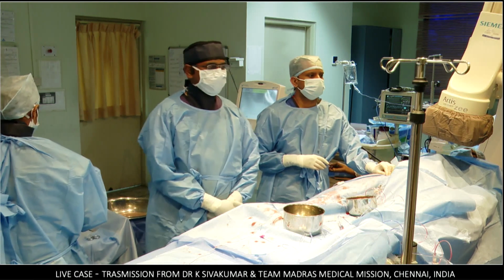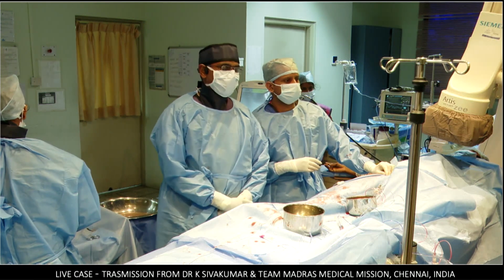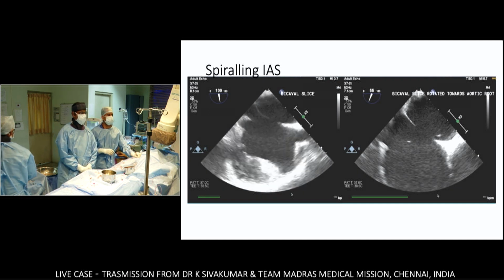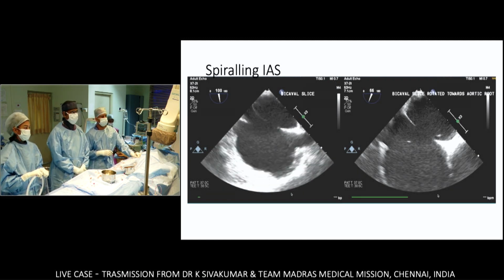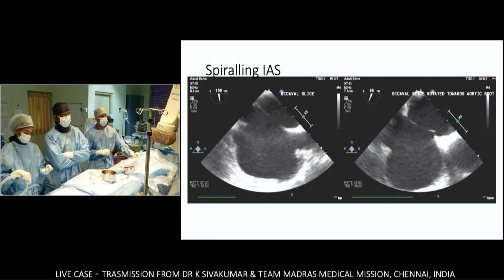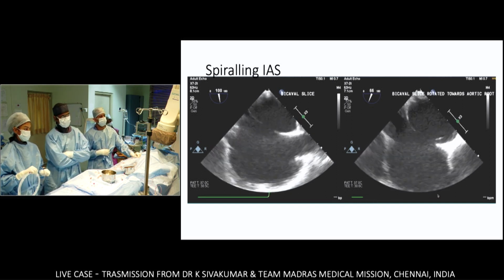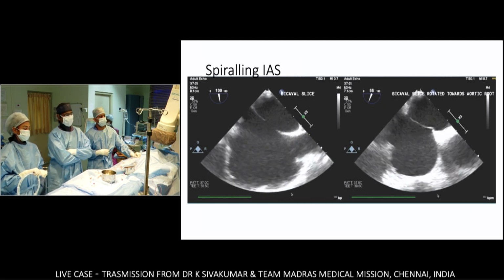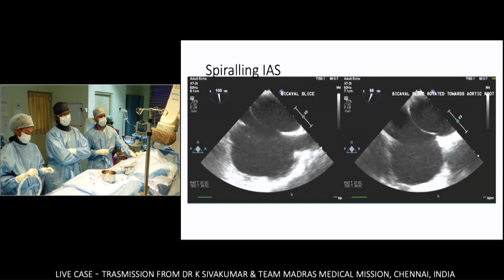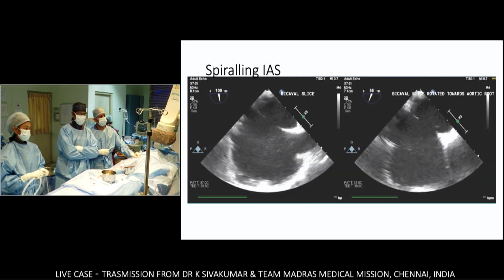Alka, can you go back and run that PowerPoint 2 slides back, when the movie of the transesophageal image was seen? Can you run both the images? Here we can appreciate, Shaq, that there is a mild malalignment of the septum. The septum primum, which is coming from the inferior vena cava area, is slightly deviated more towards the left atrium, closer to the probe, whereas the limbus, which represents the septum secundum, is slightly more towards the right atrium. Some amount of offsetting, some mild malalignment.